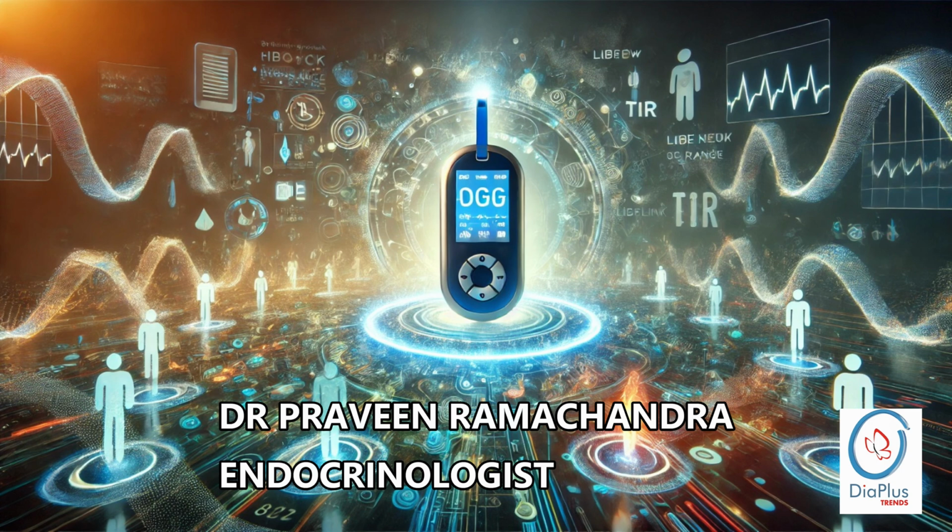It's kind of like trying to navigate a city with only one aerial photo. You get a sense of the layout, but you miss all the important details like one-way streets or traffic or detours. A1C doesn't reveal the daily ups and downs of your glucose levels, and those little fluctuations can really impact your health over time. So we're missing the detours in our glucose journey. Exactly. What impact can these hidden fluctuations have on our health long term?